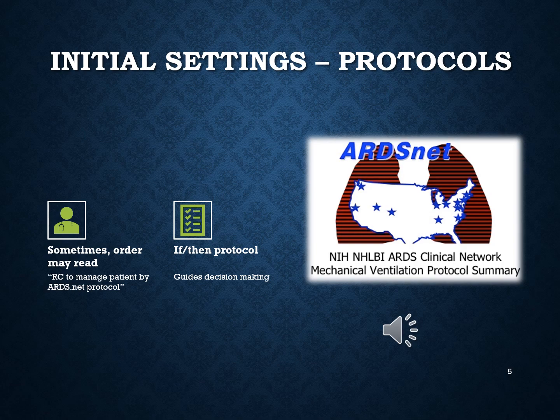So if your blood gas reads this, you're going to follow the steps according to that blood gas that you reported for that patient. So if your physician orders this, for example, it saves you the trouble of having to call your physician to adjust any settings once you do obtain that blood gas.